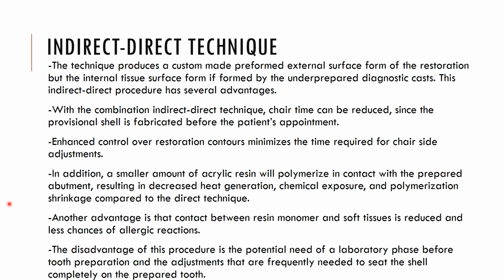The disadvantage of this procedure is the potential need of a laboratory phase before tooth preparation and the adjustments that are frequently needed to seat the shell completely over the tooth.